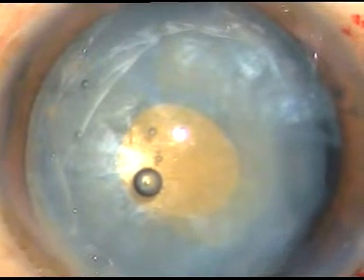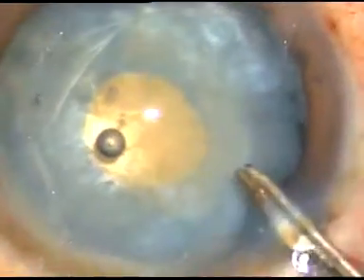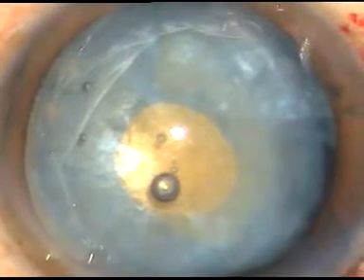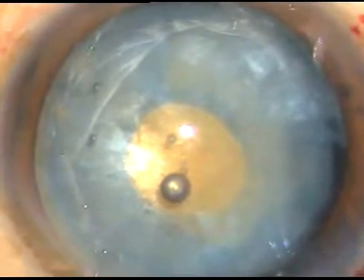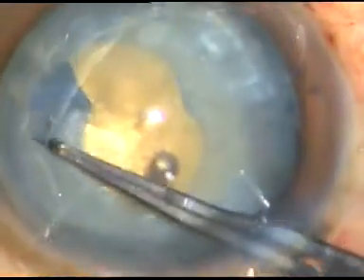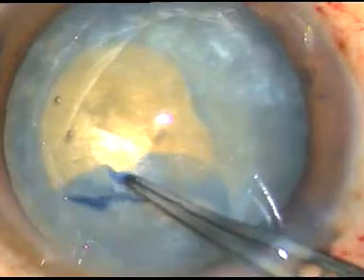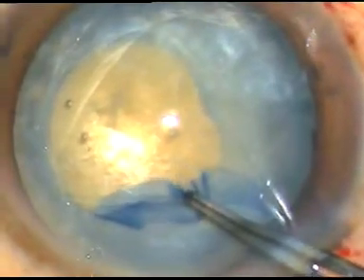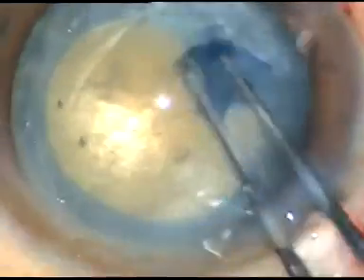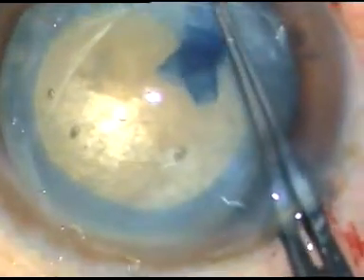I just have to enlarge this rhexis into an optimum-sized one. I take a Vannas scissor, go towards 7 o'clock, make a nick. And take the utrata again. Hold this capsular tag, go anti-clockwise, and try to remain at equal distance from the margin of the pupil. And thus, I get an acceptable rhexis.